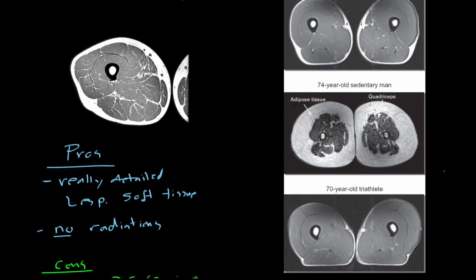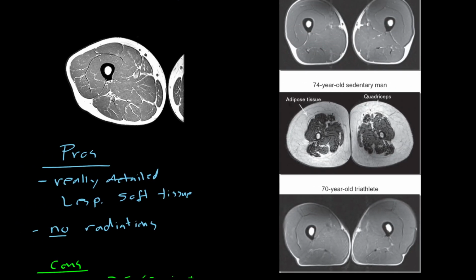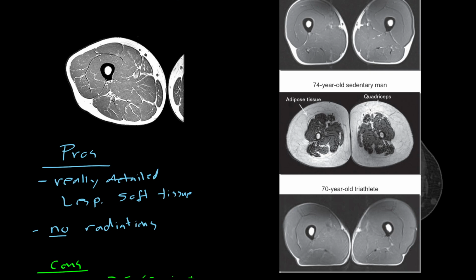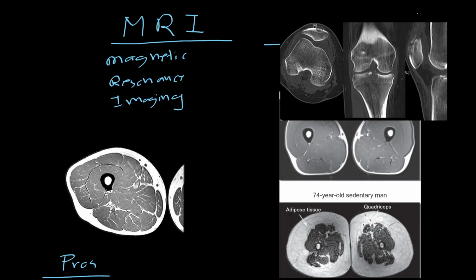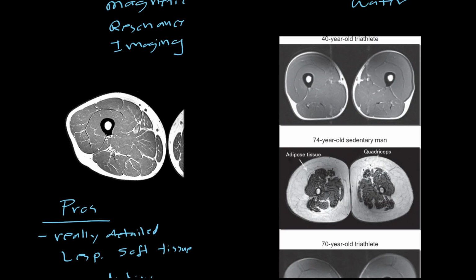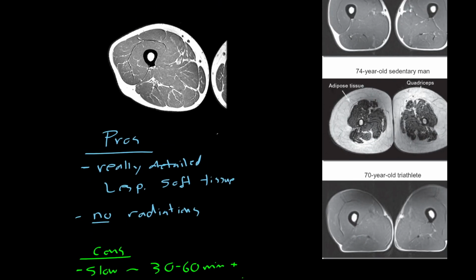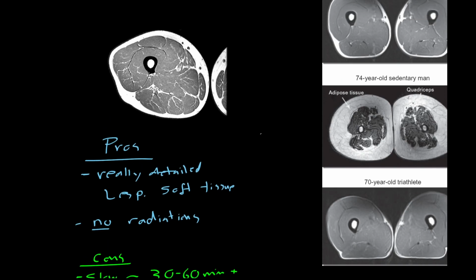But one of the things you may have noticed on the CT scan, and let me bring that back up so I can show you, is that you can get a little bit of a better picture of what's going on inside the bone. There we go. So you can get a little bit of a better picture of the structure here, and there's even some nice, maybe more research grade CT stuff that you can get the micro architecture of the bone. But of course the trade-off is you got to bombard the body with radiation to do it.